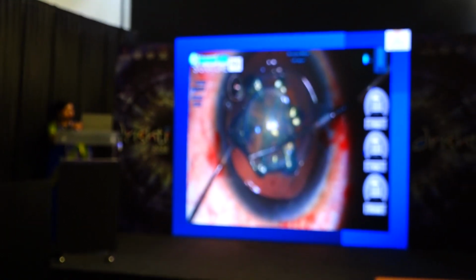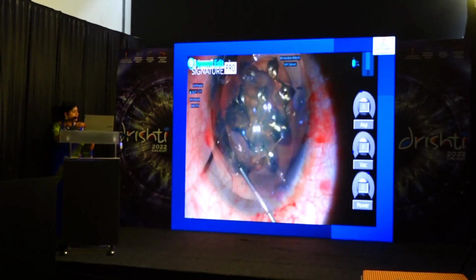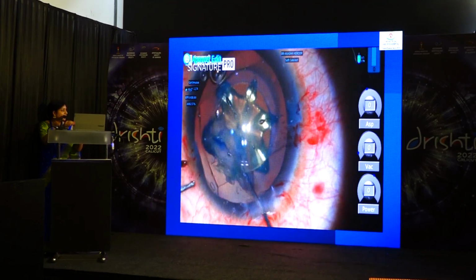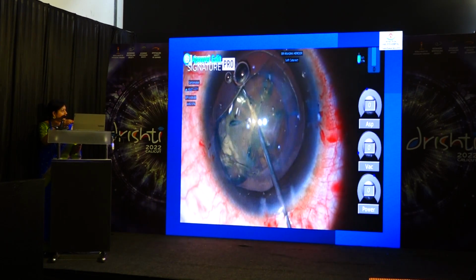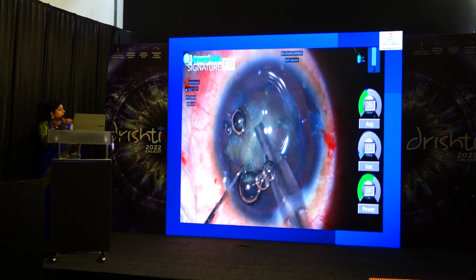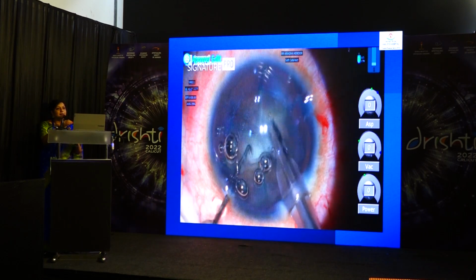Now, I was sitting temporally and now we first bring the IPCL into the anterior chamber and then above the iris and then make it vertical. I then go ahead and remove the capsulotomy flap. We need to be very careful in these situations because there is slightly reduced visibility and a little bit of the cortex also has been disturbed, and I'm doing phacoemulsification underneath the phakic IOL.